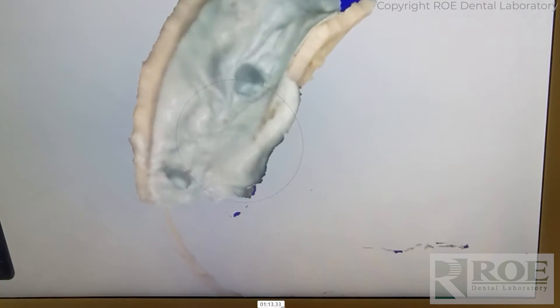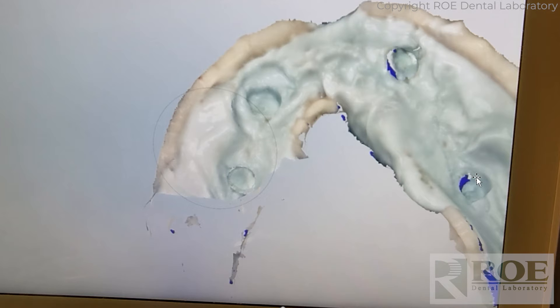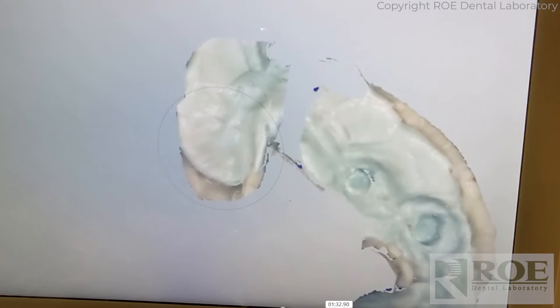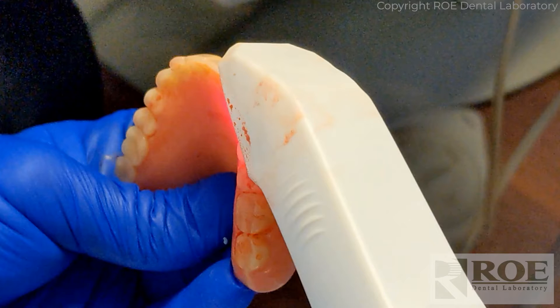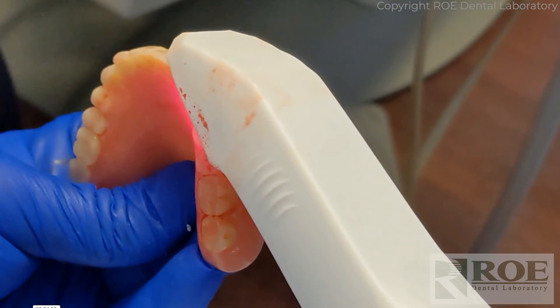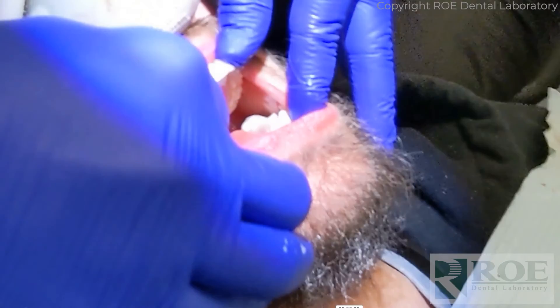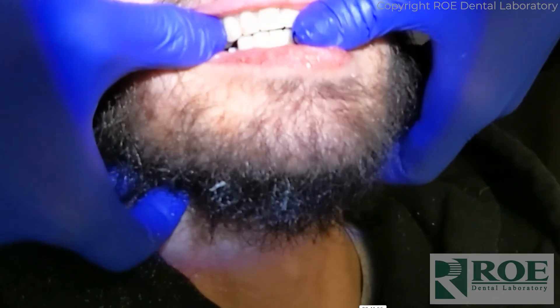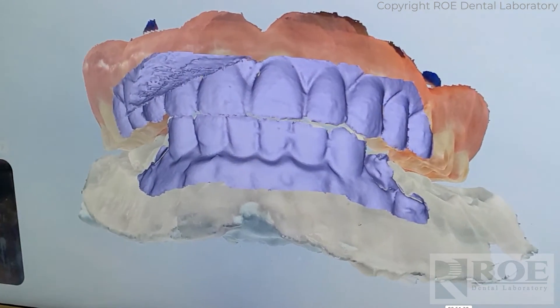We scan the whole denture and the intaglio. You can see the negative of the scan bodies and a negative of the mouth — it scanned perfectly. The next scan is just of the teeth of the opposing, because we need a bite. We remove the denture from the mouth, scan the teeth — and I believe it is actually a denture — just a crown and bridge impression of the teeth, then scan the bite. That's recorded nicely.